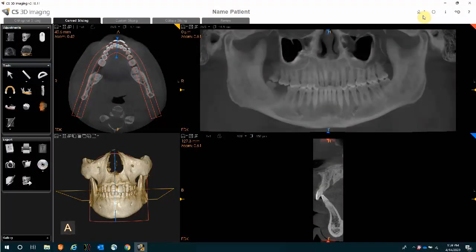Let's go over the steps on how to add an implant manufacturer. In your software, in the upper right corner, there's an icon that looks like a down-pointing arrow. If you put the cursor over that icon, it will tell you that this is the implant library management tool.